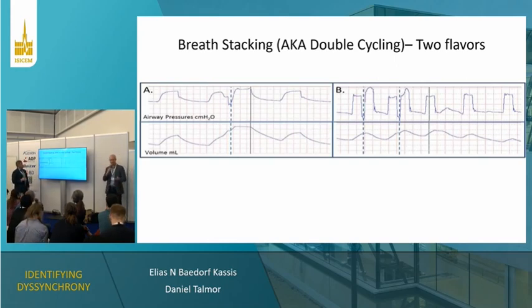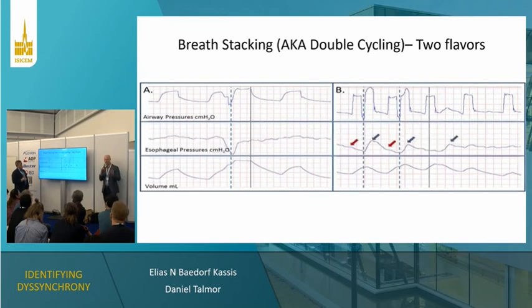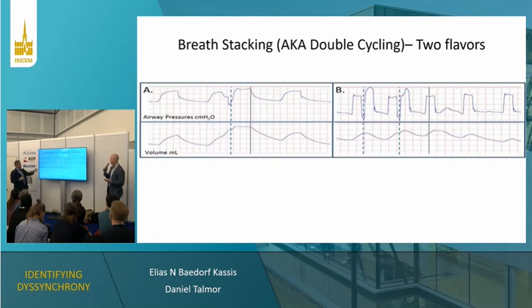And I'm sorry, it keeps on flipping ahead without me actually doing it. I'm not sure why, so I apologize. So in this case here, we're trying to differentiate between the two flavors of breath stacking, right?